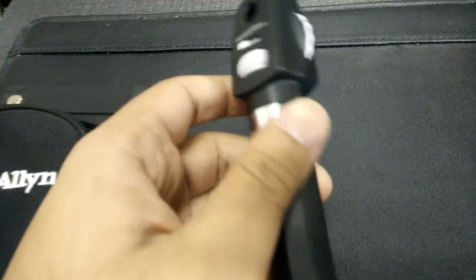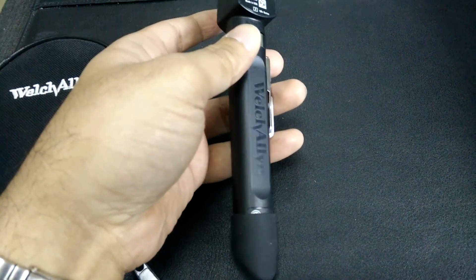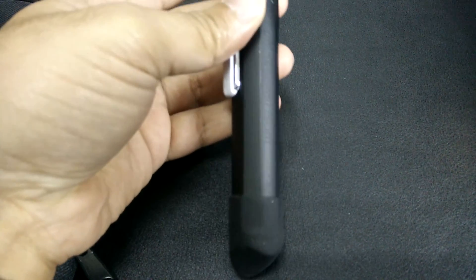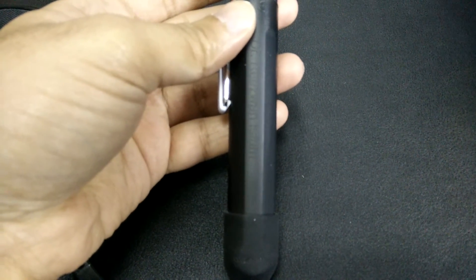The ophthalmoscope is very small and fits very snugly in your pocket. It is actually very light as well. And as you can see I have already gotten my name engraved in it, and this is a service which is provided by the website.